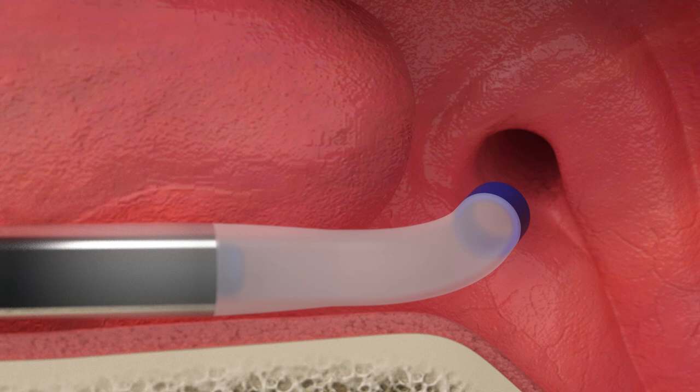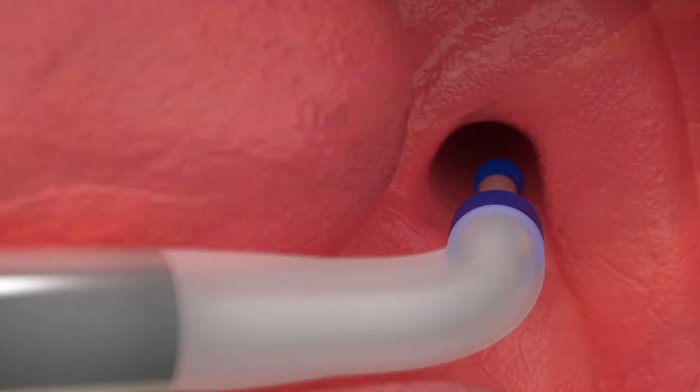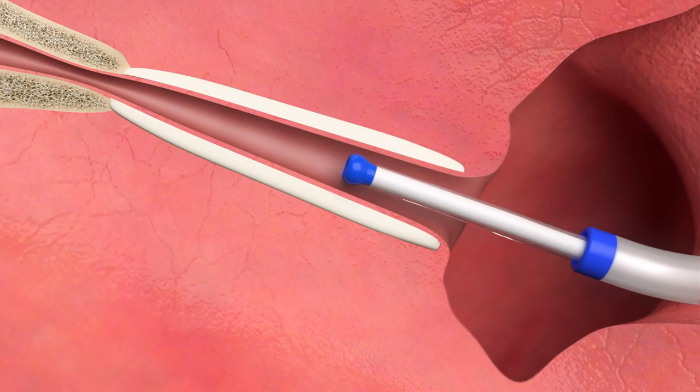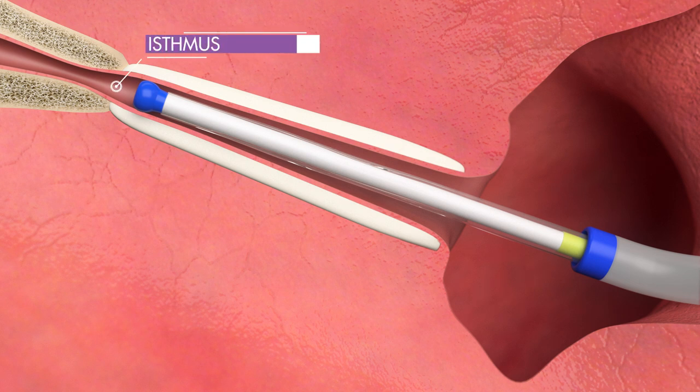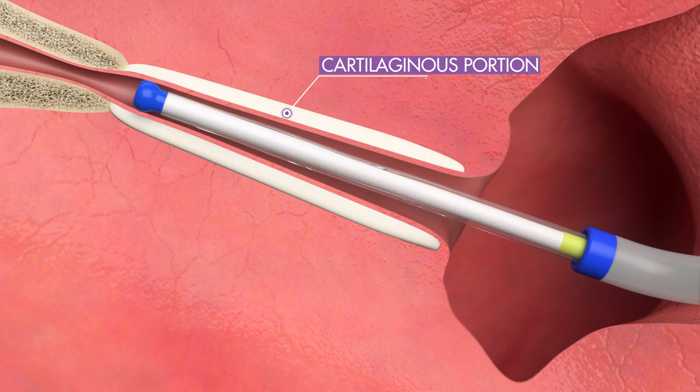Advance Aclaret Era into the eustachian tube. Advance the balloon until the yellow proximal marker exits the guide catheter or until resistance is felt. The resistance indicates that the bulb tip has reached the narrow isthmus to align the balloon with the cartilaginous portion of the eustachian tube.